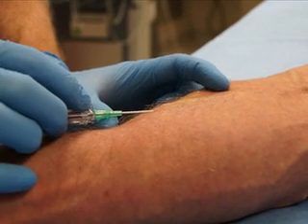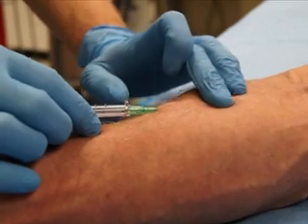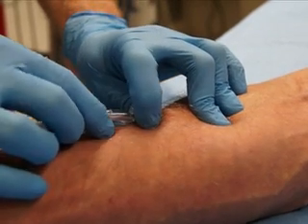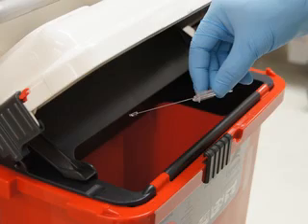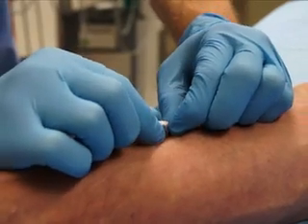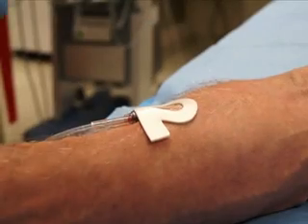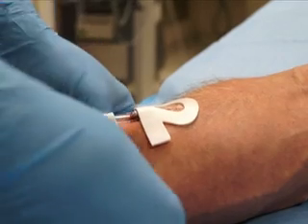While holding the needle still, slide the catheter into the vein. Apply firm pressure to the vessel proximal to the tip of the catheter. Remove the needle and place it into a sharps container. Remove the tourniquet. Place the Luer lock adapter on the end of the catheter. Anchor the catheter, adapter, and connection tubing to the skin using adhesive dressing.